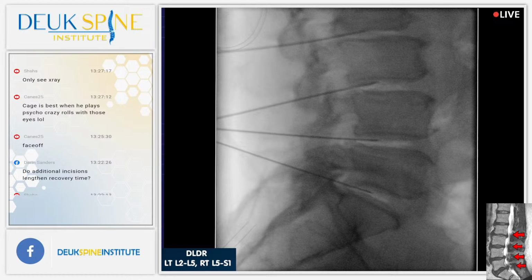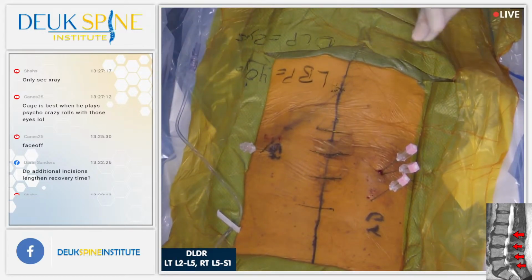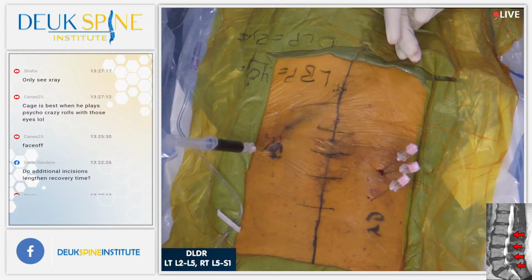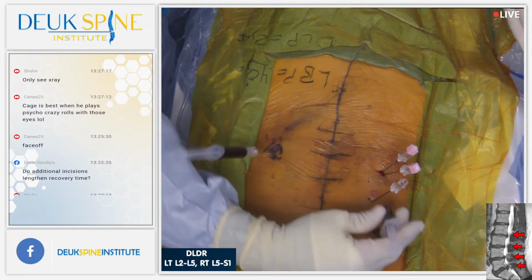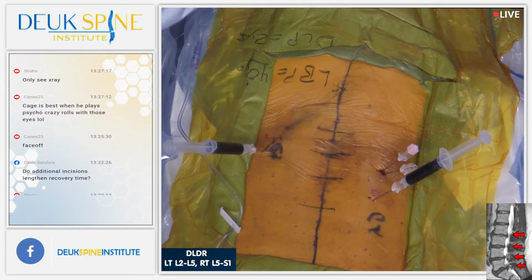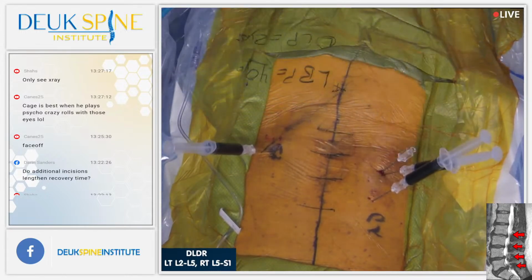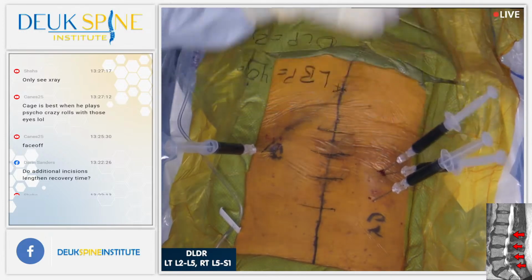So, folks, if you're watching the surgery, the hardest part of the surgery we've just completed. It's always placing the needles, literally 0.5 millimeter accuracy. There's little holes that I pass through in the back of the spine, not just the neuroforamen, but between bones, transverse process, iliac crest, to get to where I need to be. And I got to say, we got lucky again in getting past some really narrow spots. It's kind of like when you watch those movies with the ships coming in. They got to navigate through the reef, right? If they go a little too much to the right, they're going to hit the coral heads and they're going to punch a hole in their hull and drown. And if they go a little to the left, I mean literally a foot sometimes.